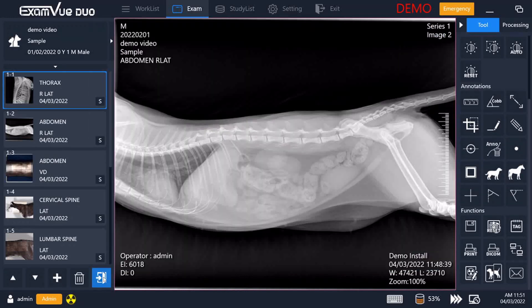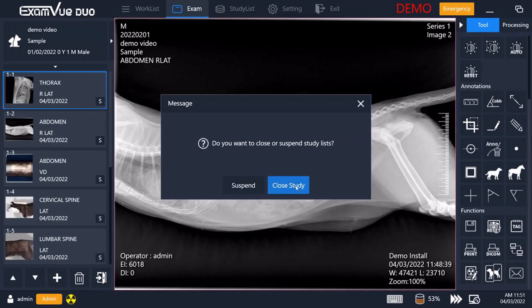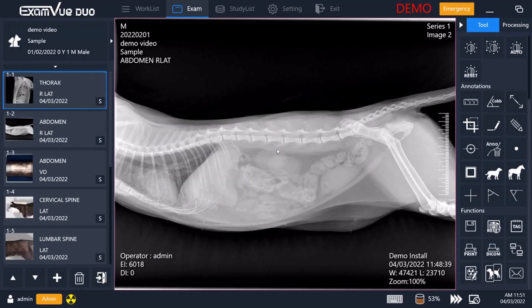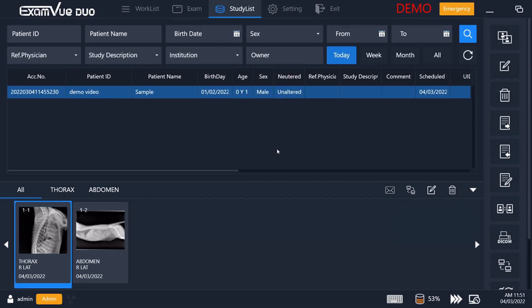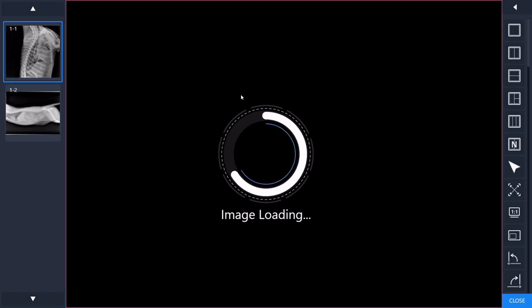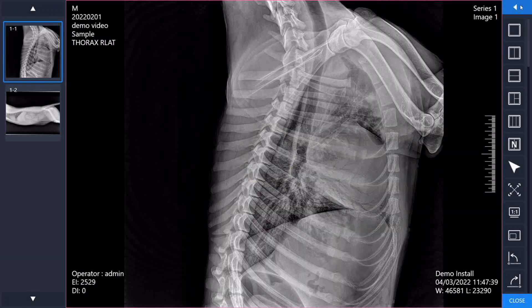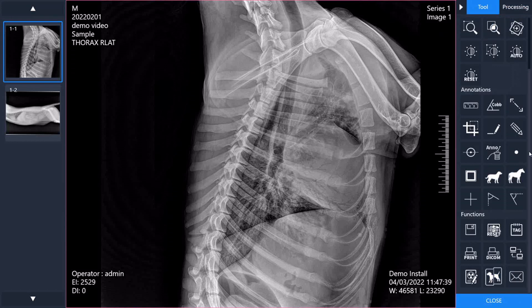When you're all done, you'll close the study. This will send it to your PACS if you have it set to automatically send, and will export them as a JPEG if you choose to do that automatically as well. It will bring it to your study list where you can go and see all of your previous X-rays. In the study list, you can simply double click on any study and open it up for viewing, where you'll have access to all the same tools you had when taking the X-ray.